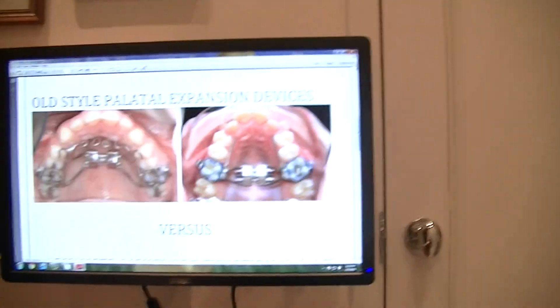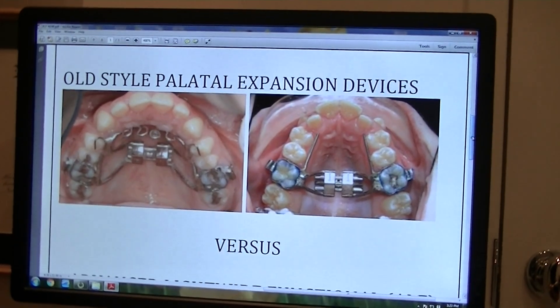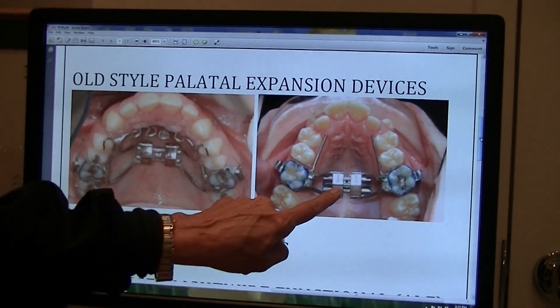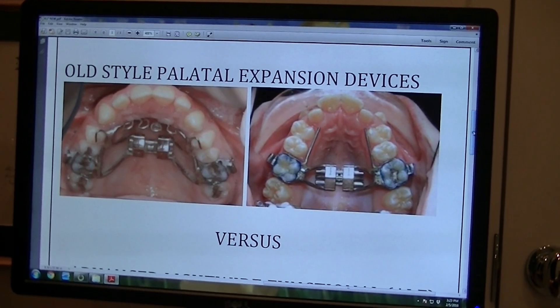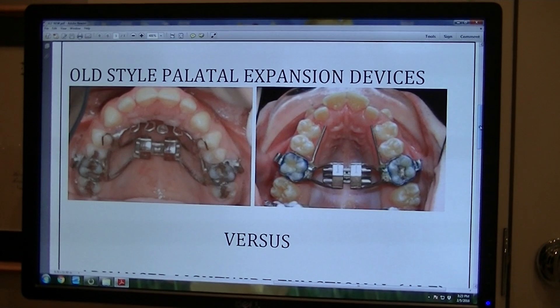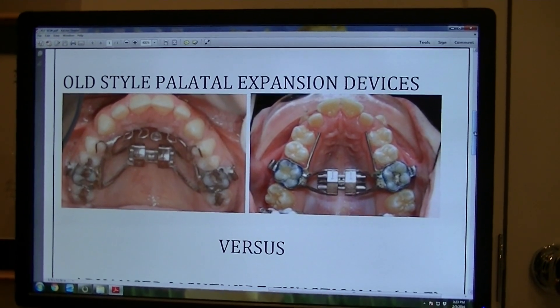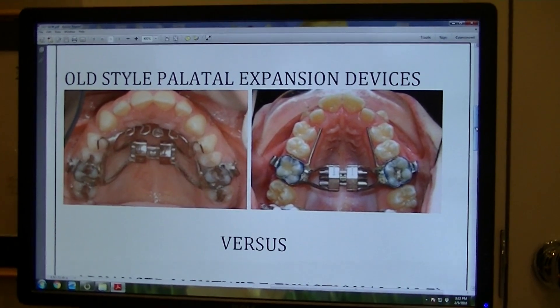I'd like to show you on the screen some of the older style palatal expansion devices that we used to use. These are some typical rapid palatal expander devices where you had to insert a key and crank it in order to create the expansion, and the parents were responsible for doing this at home. We've eliminated any parental involvement in the treatment these days.